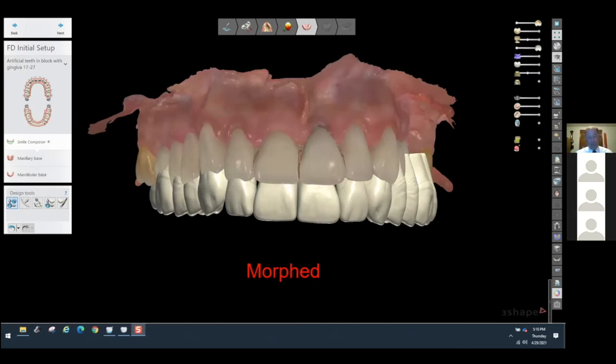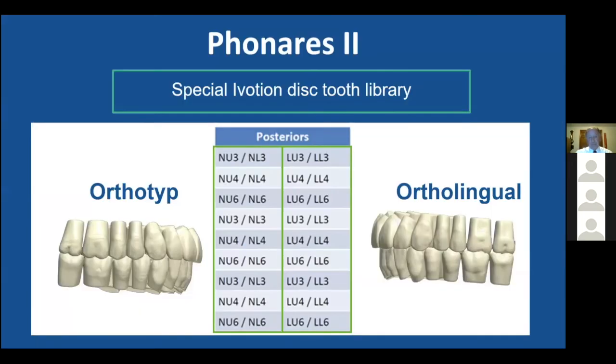And believe me, it only takes me a minute. It's just knowing your tools and playing with them a little bit, and you can make a really neat improvement. I mentioned immediate dentures. Do you realize how nice this is for this patient? I'm going to be positioning these teeth as close to where they were, and this patient really wants these teeth to look the same way. And I thought, what a wonderful service that can be for the patient.